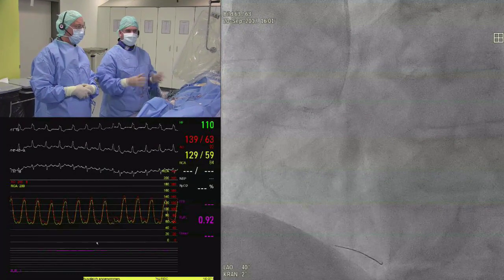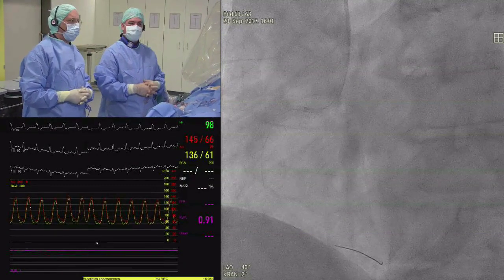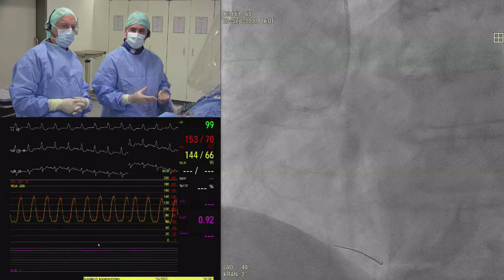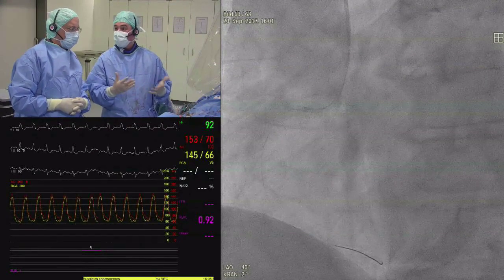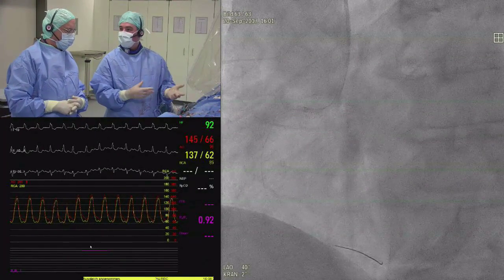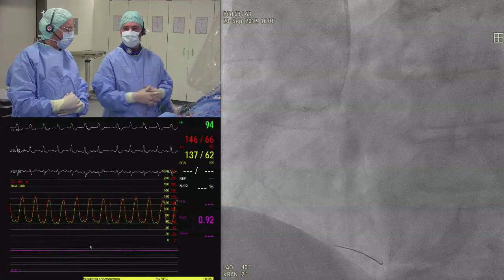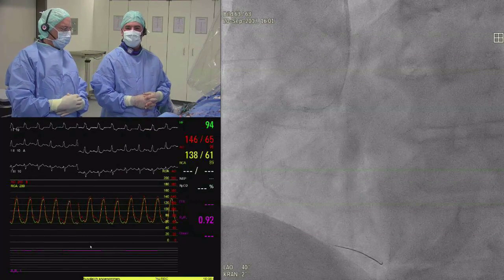So I think it does make differences which wire to take for which lesion if you are lucky enough to have several ones available. So my experience is really we try to plan ahead, and I think that's important for all of the stuff we're doing, to think about what kind of lesion you're expecting, how much calcification. If you want to do iFR, IVUS, and FFR, probably another company might be more suitable doing the job, as we've seen in the case before. Or if it's difficult to get that wire down, then another company might be better. So I guess, in my opinion, it makes difference. That's how we do it. We decide on a case-to-case basis what wire and what system to go to really make sure that we have the best result at the end for the patient.